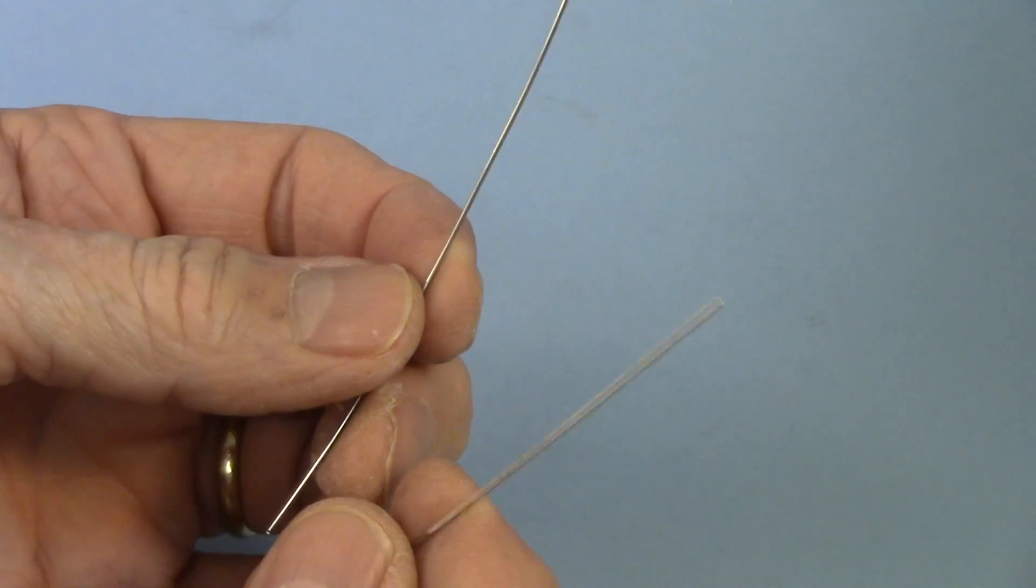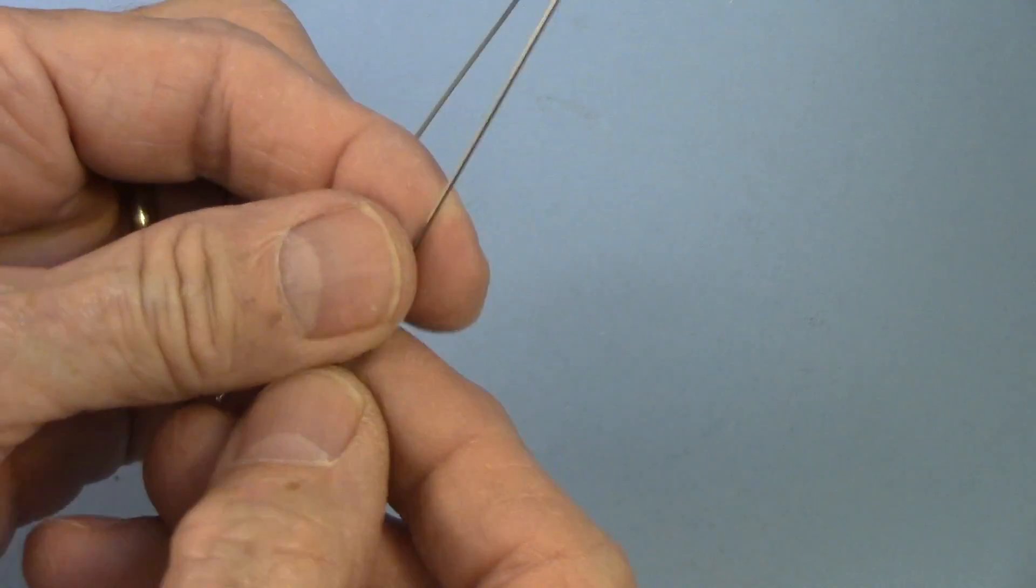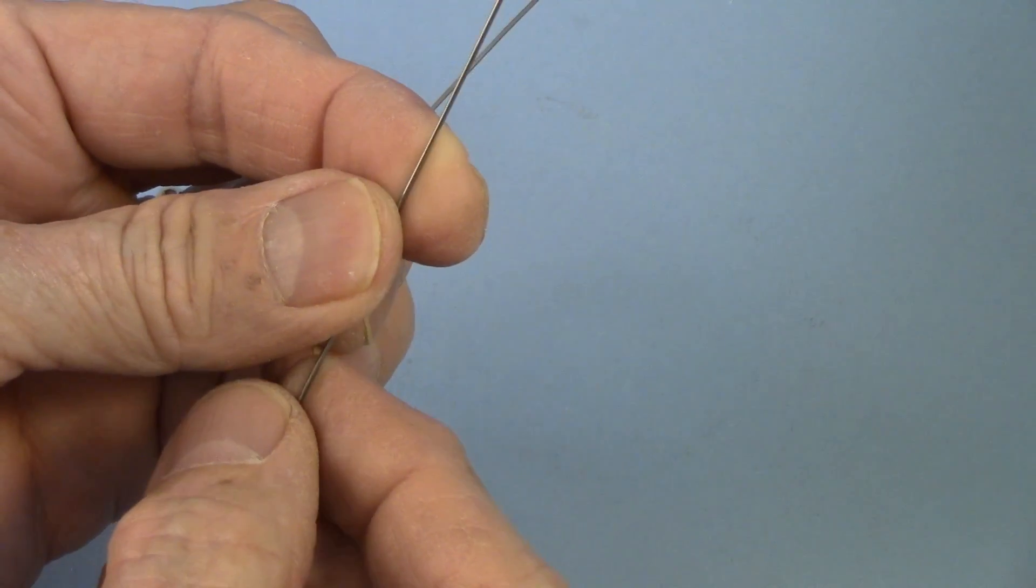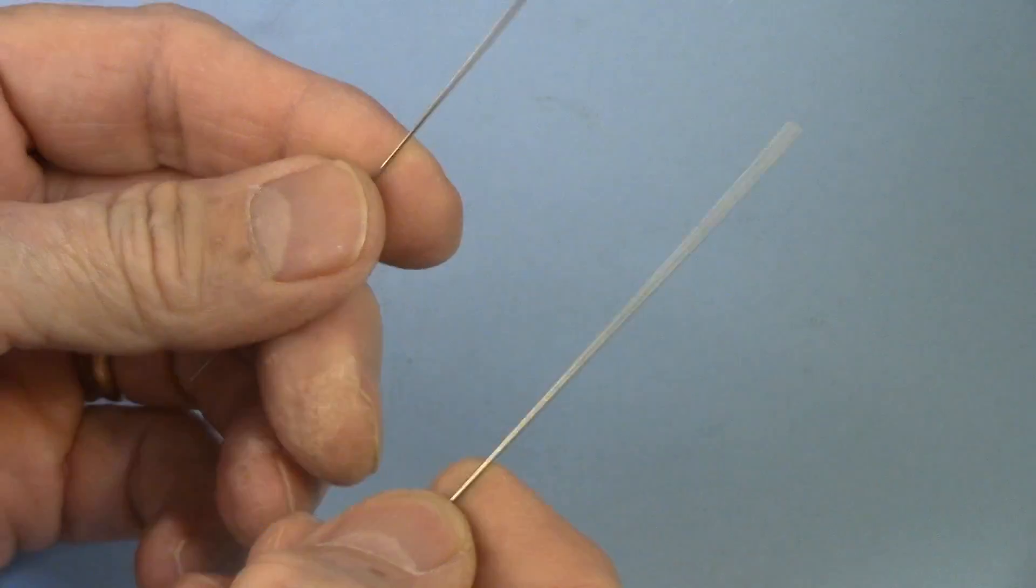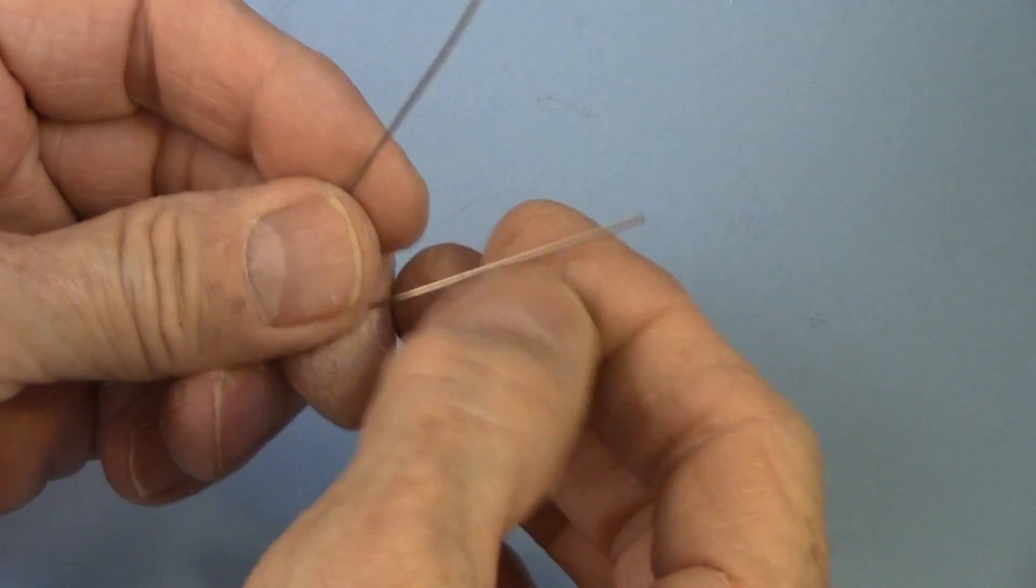Now, the cobalt alloy wires are more expensive, so I use the nickel-chromium when I can, but a lot of applications you really want to use the cobalt alloy wire. Now, here's the difference between the two.